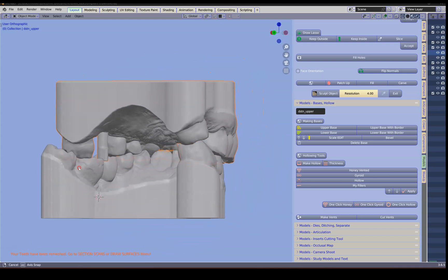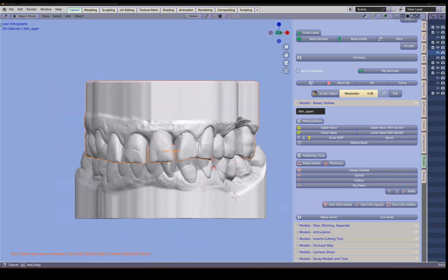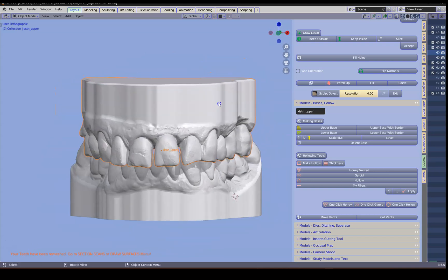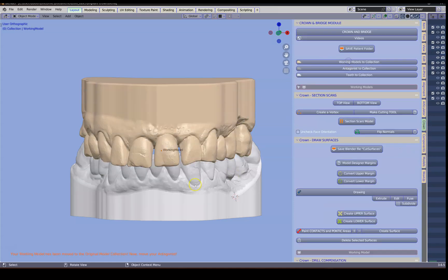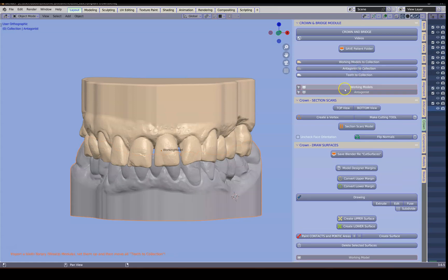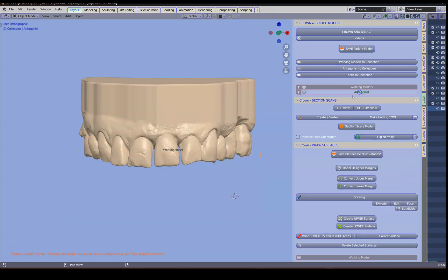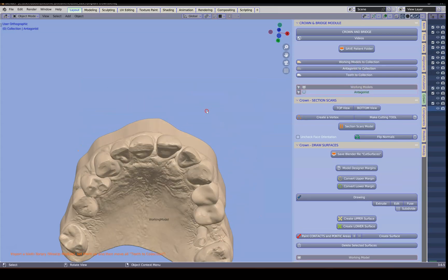Hey guys, let us make an implant crown. Select it, go to the crown module and this becomes a working model. This is our antagonist. We're going to hide the antagonist.